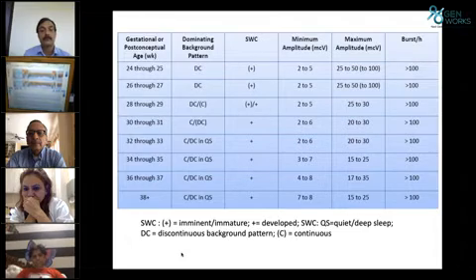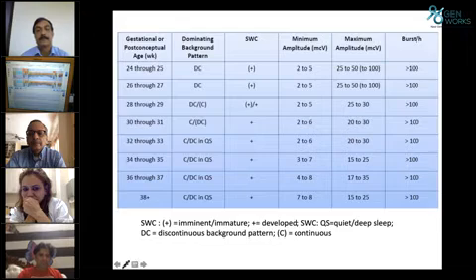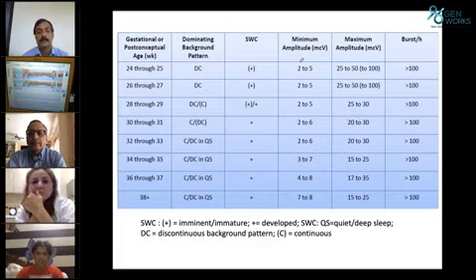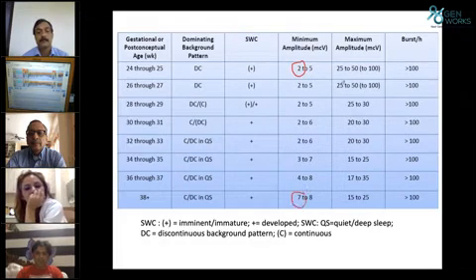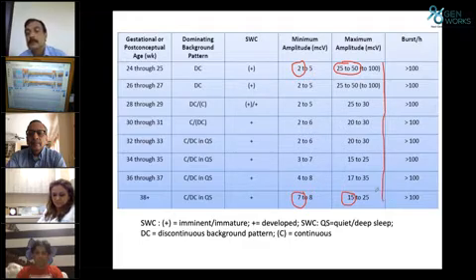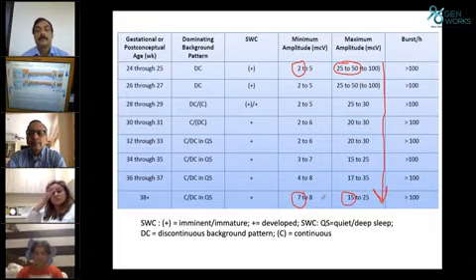From 2, it slowly increased to 7, which means more than 5. It increased as the gestational age increased. Go to the maximum. Thank you. From the maximum, it started coming down. That means the neuronal synapses have started coming together. Extra impulses, it is coming as volts, I mean microvolts. It started reducing because the brain has started organizing.